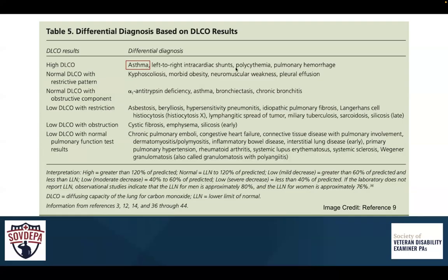I determine asthma from the fact that the FEV1 is low, and then there's reversibility after a bronchodilator. There's a 10 to 12% increase, or 200 milliliter increase in FEV1 after the administration of albuterol. That's what tells me there's asthma, okay? But say the lung PFT results show restriction, so a low FVC, and the patient's obese.